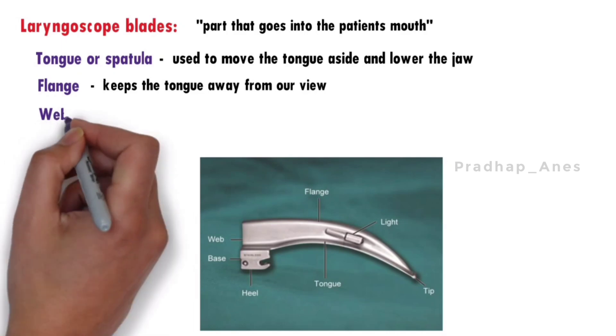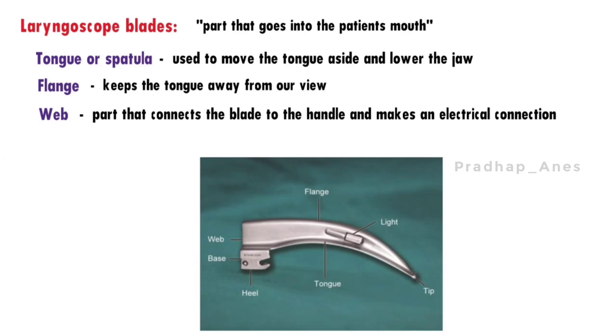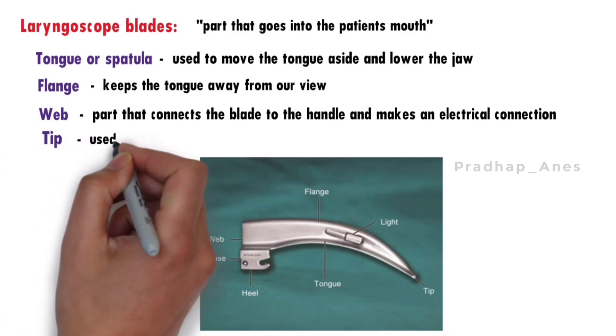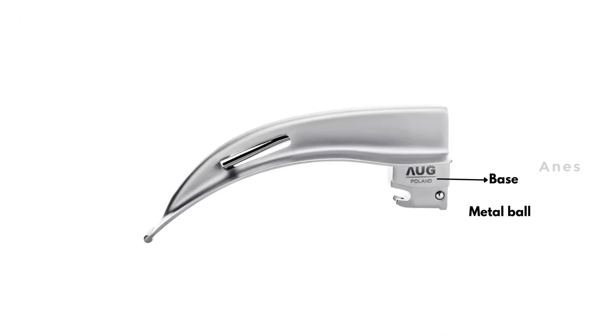The web connects the blade to the handle and makes an electrical connection when extended. The tip is the end of the blade used to lift the epiglottis, which helps with the view. At the bottom of the blade there is a metal ball that connects to the handle, and the blade also has a light source to help us see better.